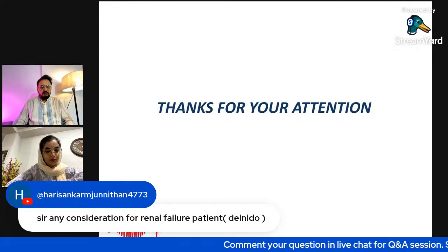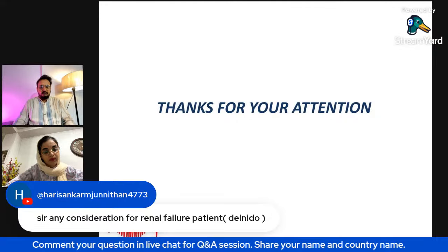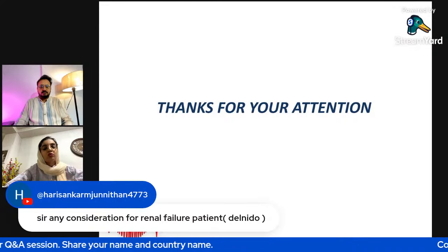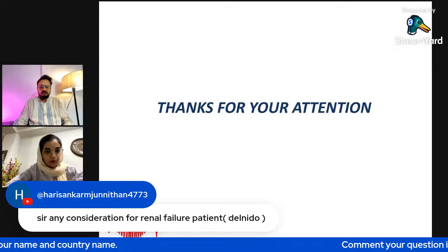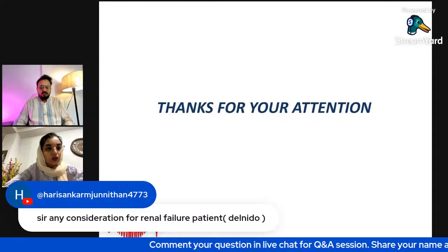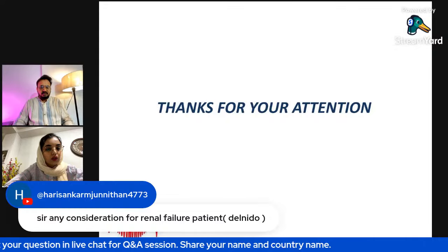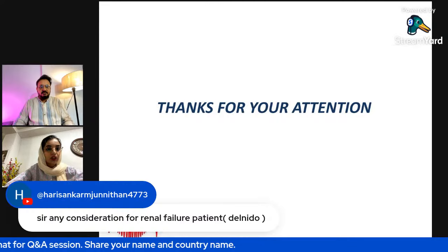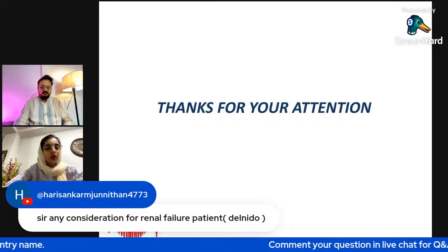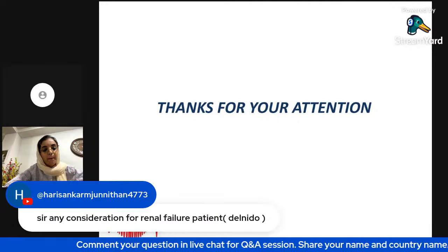We have one more question. Any consideration for renal failure patients while giving Del Nido cardioplegia? Any special precautions for renal failure patients, for example those with CKD? Del Nido is very good for them and actually helps to prevent reperfusion injury afterward.